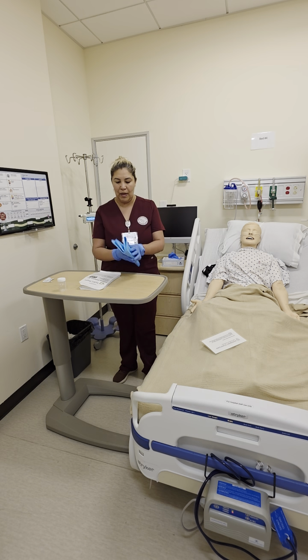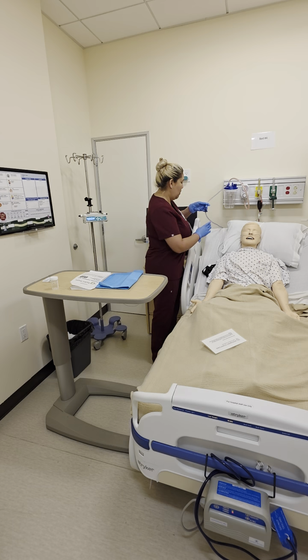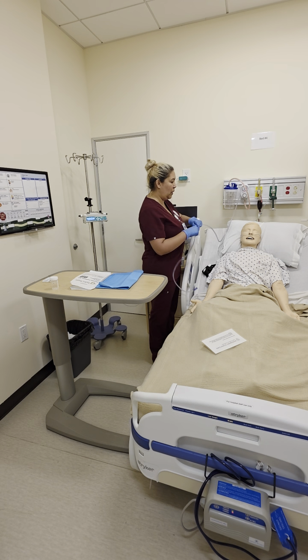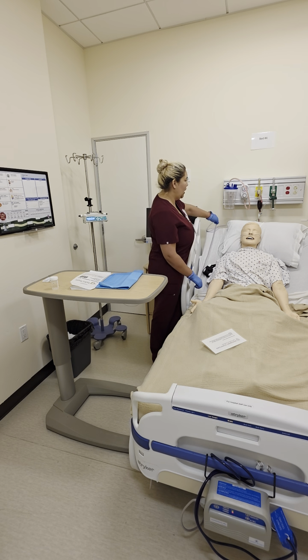Now I have my supplies, which is my suctioning kit. I have a towel for my patient. I have sterile water, KY jelly, my canister, my tubing for suctioning. My patient is already on oxygen. He's already on 2 liters through a nasal cannula.